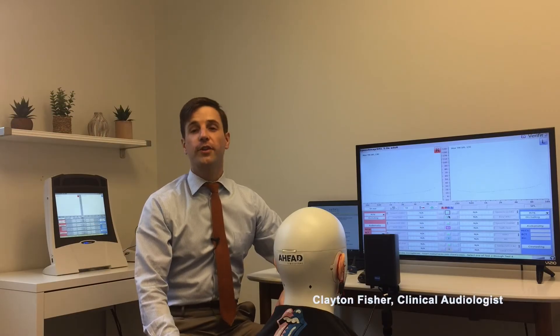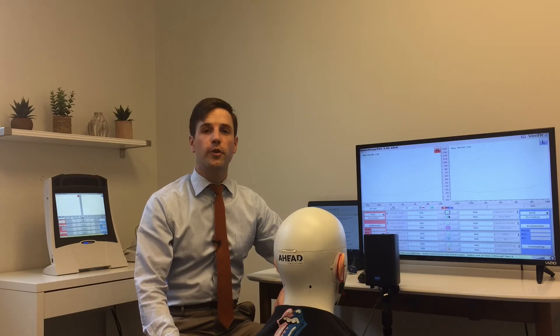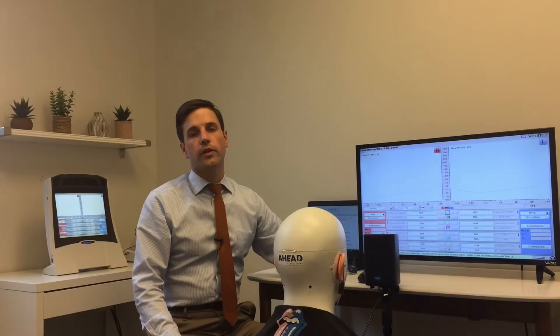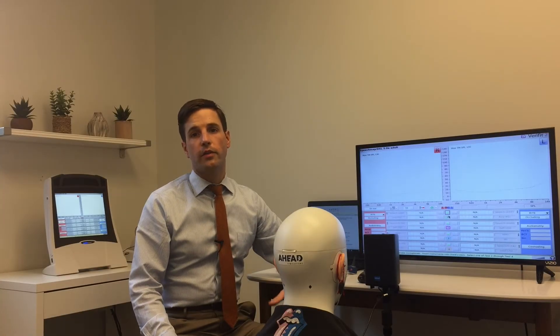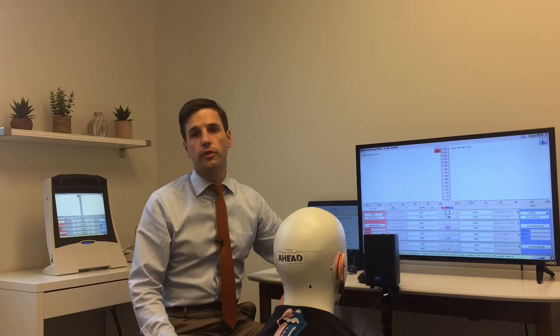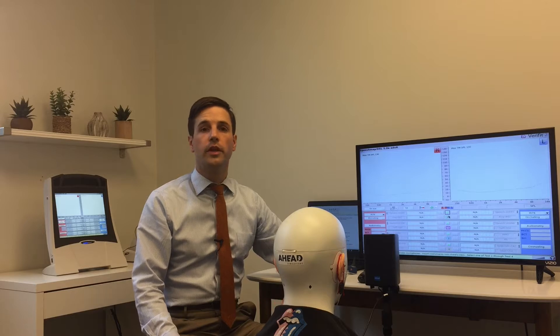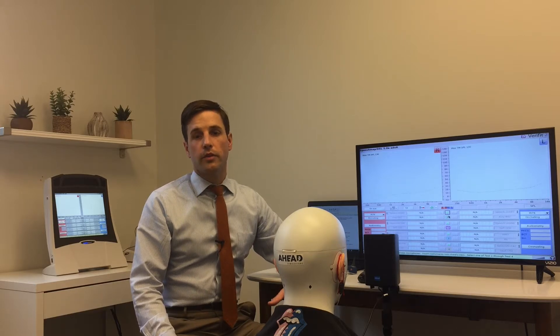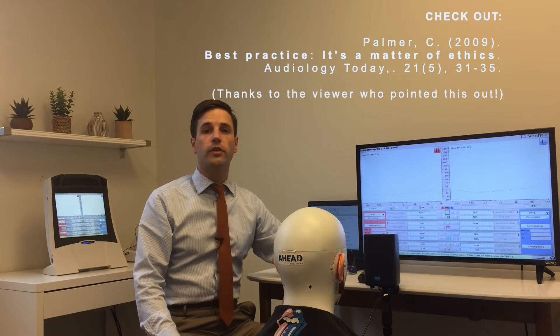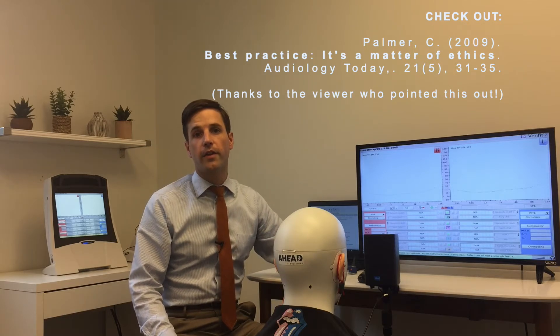Hi, my name is Clayton Fisher and I'm a clinical audiologist. Today I'm going to show you how to fit hearing aids using real ear measurement. In my last video I talked about the ethics of not verifying hearing aids — wondering if it was unethical to deprive clients of audibility. Kathryn Palmer published something in 2009 in Audiology Today that talks about exactly that: the ethics of not following best practices and not verifying your hearing aid fittings.